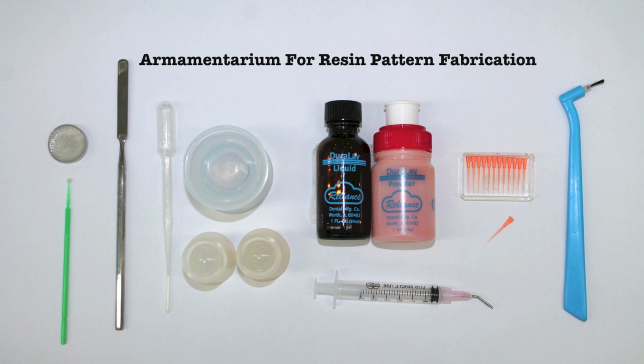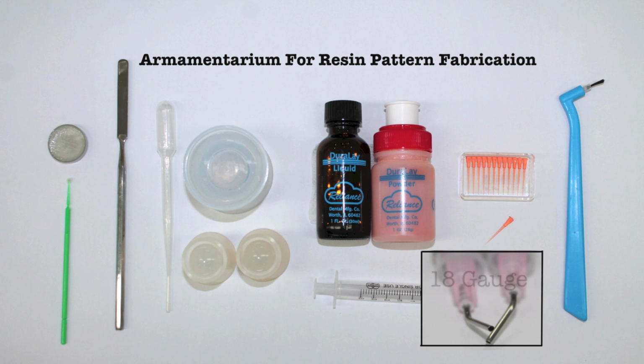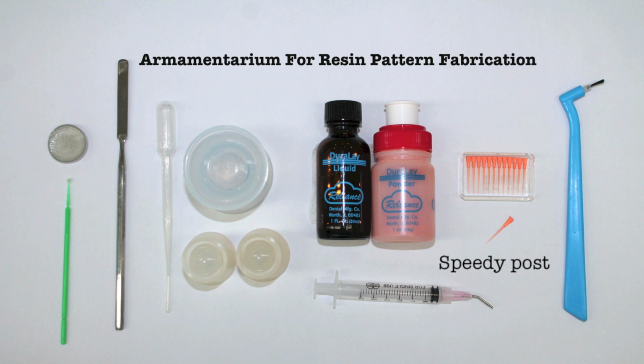Armamentarium for resin pattern fabrication: petrolatum jelly, micro brush, spatula, medicine dropper, dampen dish, resin pattern monomer and polymer, syringe with 18 gauge tip, speedy post, and brush.